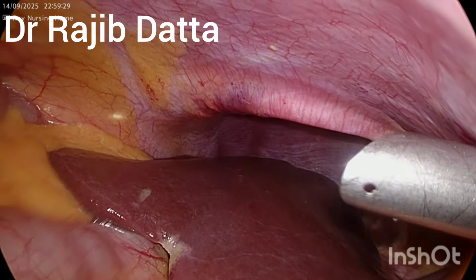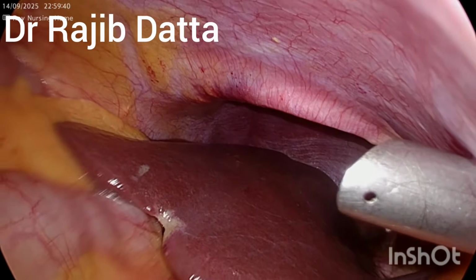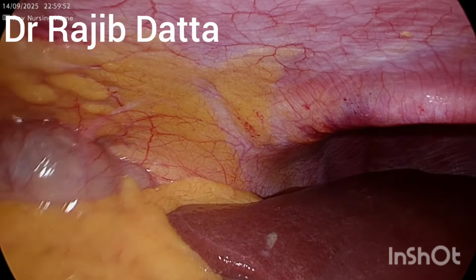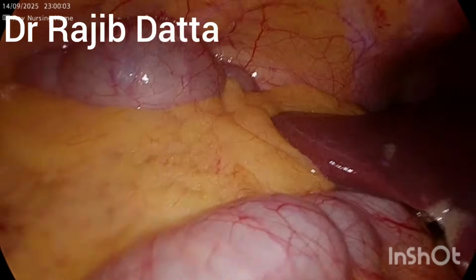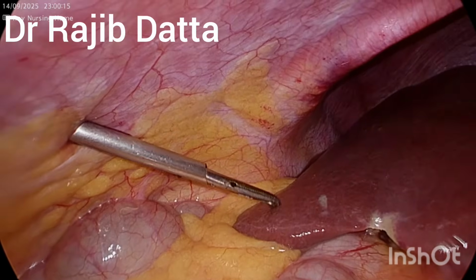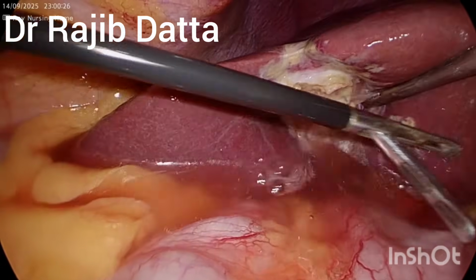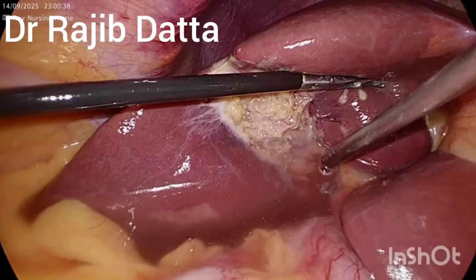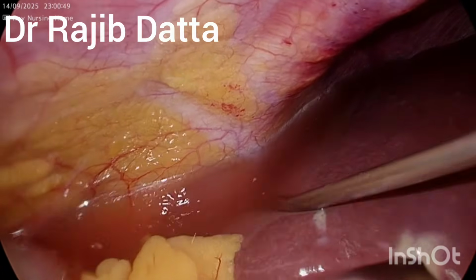So again the 10 mm 30 degree telescope has to be introduced through the umbilical port, and with the help of the epigastric port, the suction irrigation cannula has to be introduced, and with the help of the 5 mm mid-clavicular port, I am going to introduce the bowel grasper for proper visualization of the Calot's triangle clip area and whether there is any bleeding from the liver bed or not.